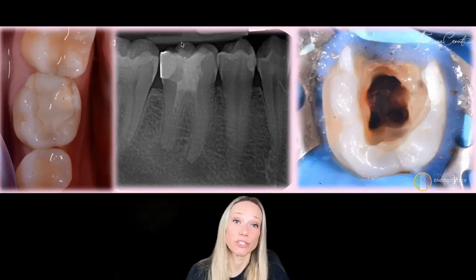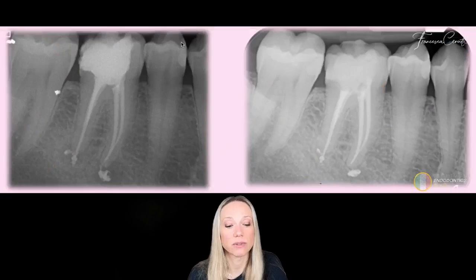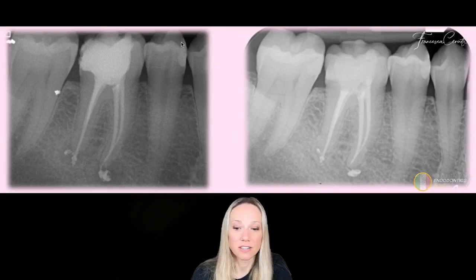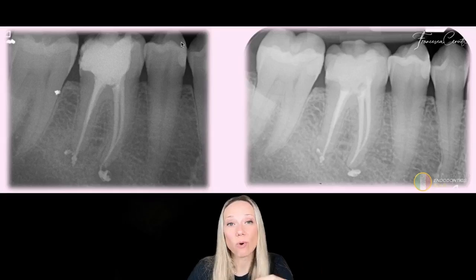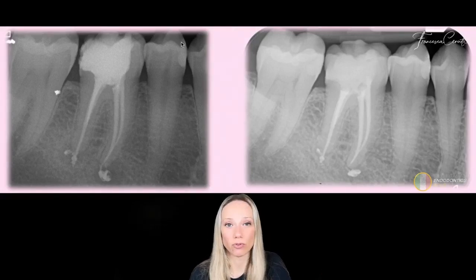In this other case in which there is a retreatment, you see that the existing treatment has not arrived even to the middle third. And so what do I do? Once I remove this paste from the root canal system, then I just have to shape, clean, and fill. And you see I'm much more conservative in this case. The healing arrives eventually, but the taper of my preparation is smaller, is more respectful of the original anatomy of the tooth. I remove only what I really need to remove in order to have my taper preparation, my room for the irrigants, and my room for the filling material.